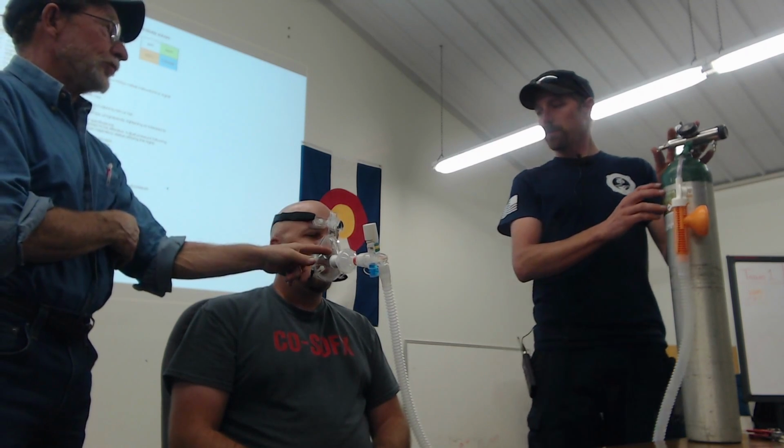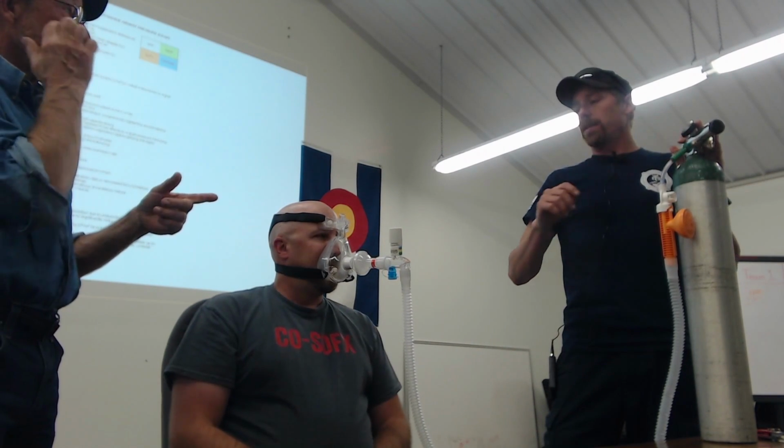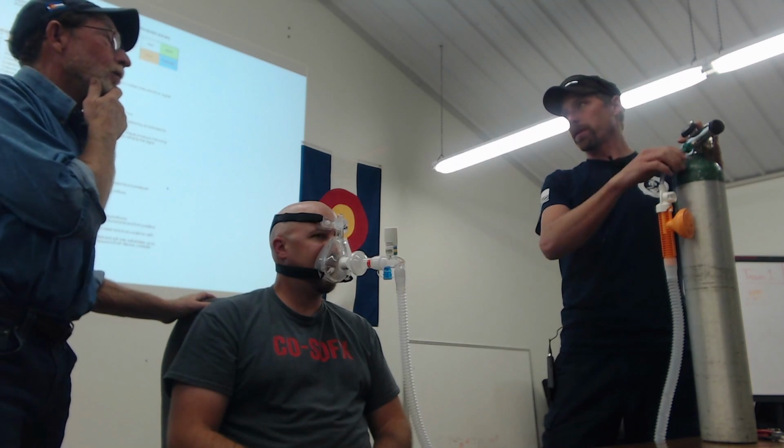So Tyler, remind me, these will be hooked up with the HEPA filter in line as they come out of the package here? Yes and no. So the other ones will actually be over here, so you won't even have to deal with it.